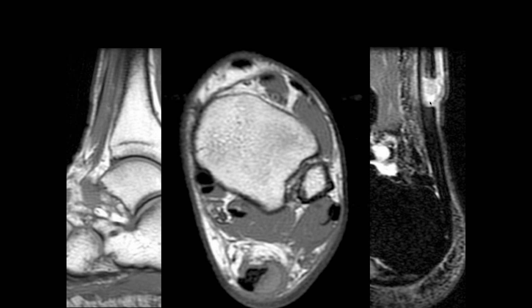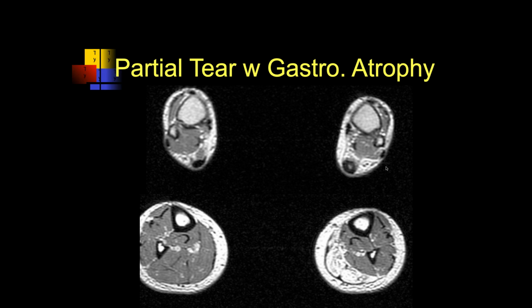Turns out this wasn't a laceration. Right out of the Greek history, John. Say that again? It's right out of the Greek history. Oh, that's where the Achilles comes from. Right, exactly. But this doesn't look like a cut because the skin looks okay. Yeah, unless it was from the side. Right. I've never seen a tear so sharp. Yeah, I agree. It could have been cut from the side. Yeah, it's what it looks like.